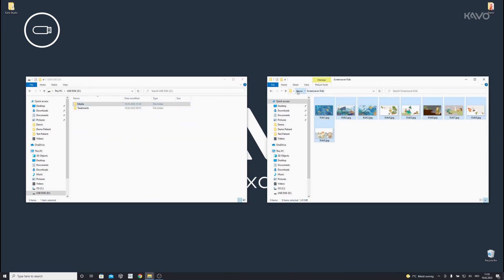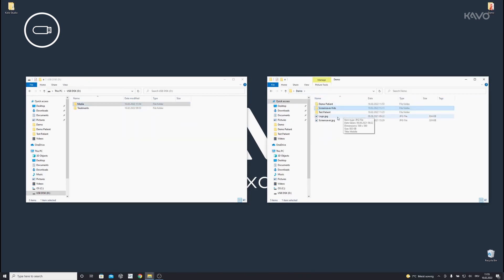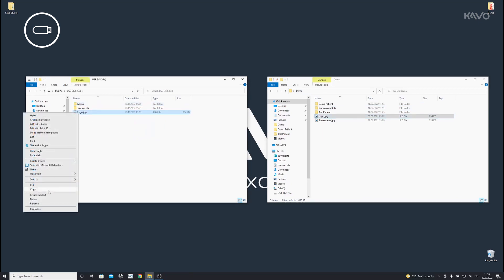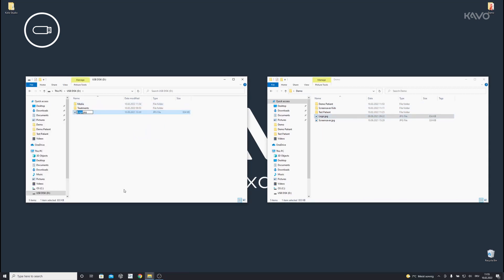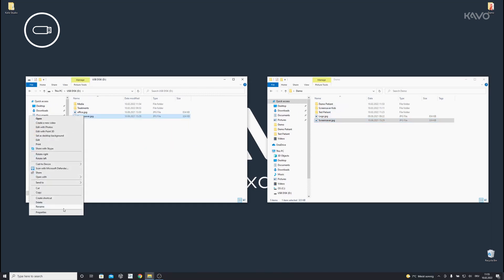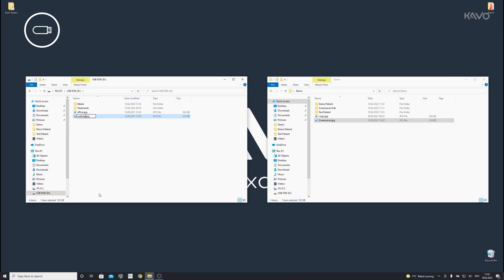To import your Office logo, copy the desired logo to the USB drive and name it Office.jpg. To import a screensaver and set it directly on a treatment unit, copy the desired image to the USB drive and name it Wallpaper.jpg.